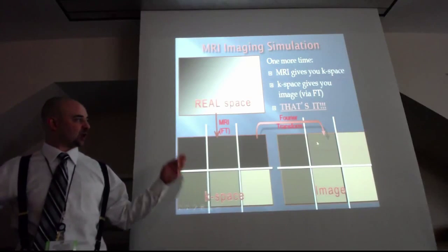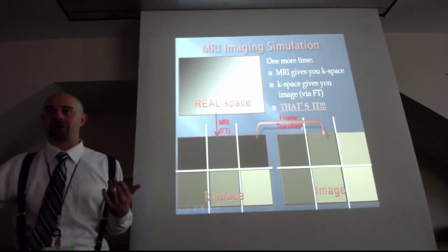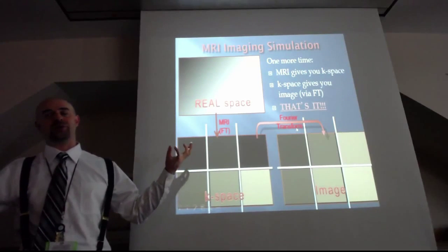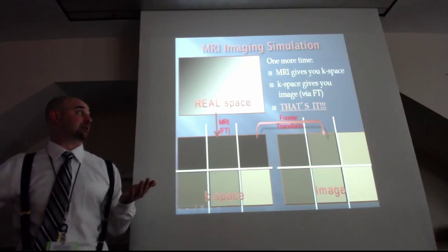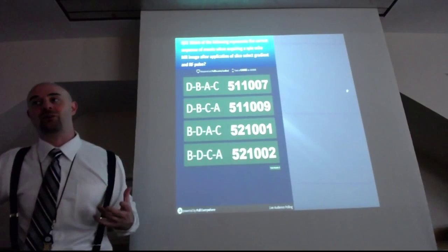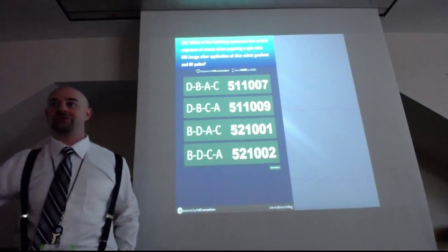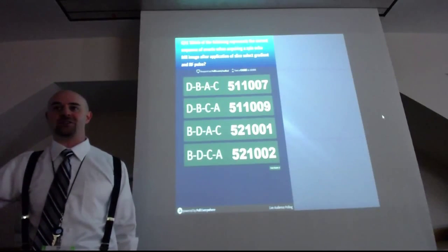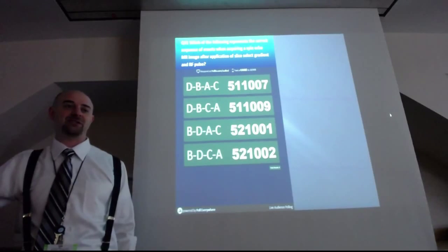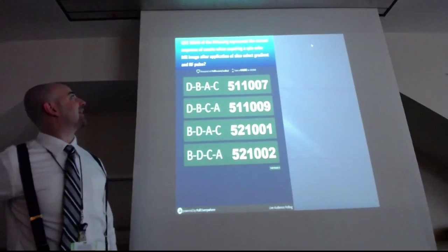And so these spatial encodings work, and you can prove it in this reduced special case. Even algebraically, you can prove it works. So with a more complicated mathematical technique like Fourier transform, it stands completely to reason, right, that it works. I'm just trying to make you guys trust it, because I know no one believes in k-space. They think it's all gibberish and fake. All right.